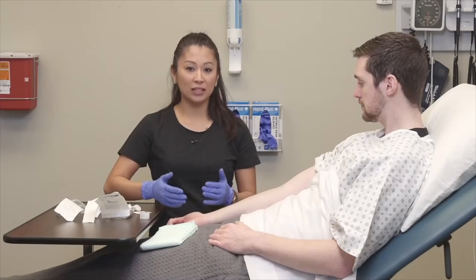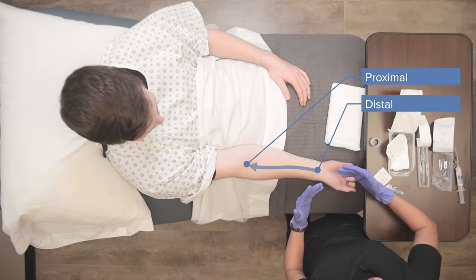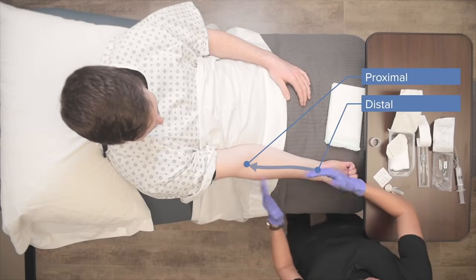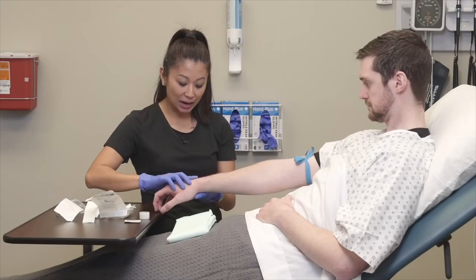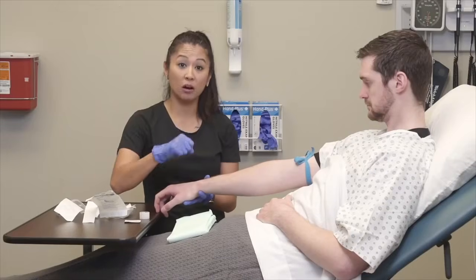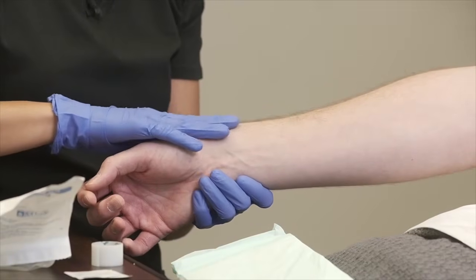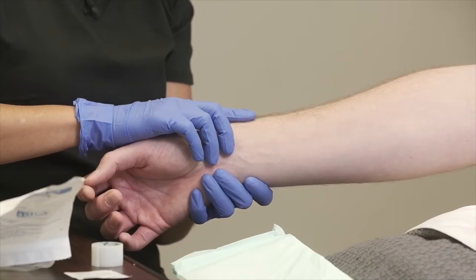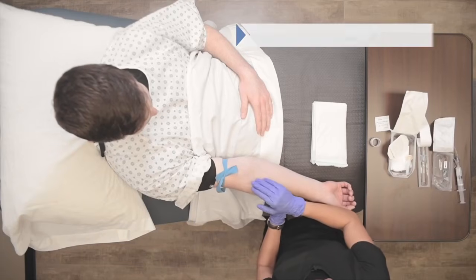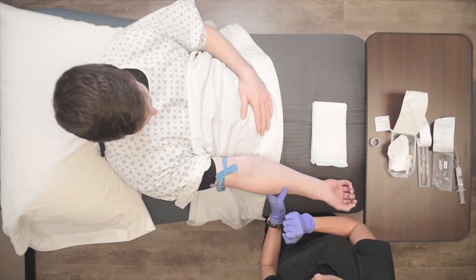So when we're looking at veins, we want to start with IV catheter insertion from distal to proximal. The reason why we want to do this, if we start an IV down here and we have complications, we want the ability to move up. All right, so when we're assessing IV, what we want to look for is there's great veins in the hands, but this can be uncomfortable if a patient's eating. I have a personal favorite. There's some that are here on the side as well that kind of run the thumb side, and you can kind of see me pressing on it. Also, of the very popular, there's some in what we call the AC or antecubital on the inside aspect of the arm.